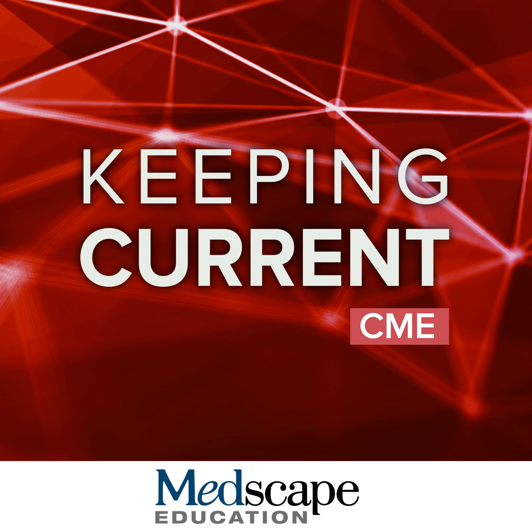First, here we have a baseline pretreatment T2 FLAIR. Post-dosing, there's a new region of left frontal edema with a small overlying sulcal effusion. Repeat imaging was performed the next month. We see improvement in that region of edema and resolution by 2 months later. So again, ARIA-E is transient and often resolves over the course of a few months.